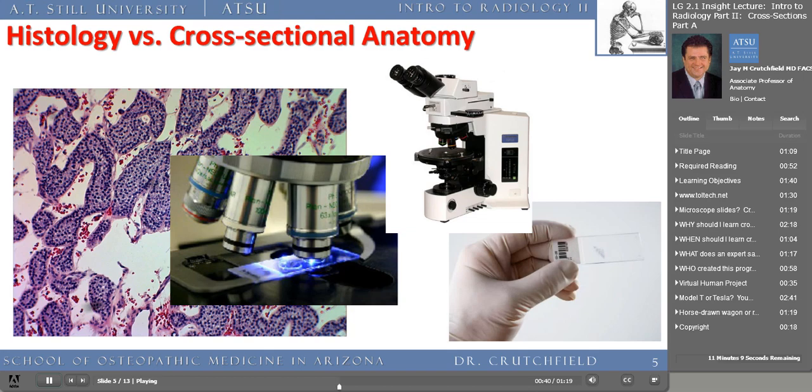We don't need to look at the entire tumor. We look at a cross-section of the tumor. From this cross-section, we can look at the structure of the cells and determine whether it's cancerous, whether it's potentially malignant. Cross-sectional histology and microscopy has been used now for hundreds of years, but now cross-sectional imagery will define your career. Clinically, it wasn't until the advent of the CT scanner or the MRI scanner that cross-sectional anatomy literally overtook hospitals. We'll take a look at some examples in this presentation.